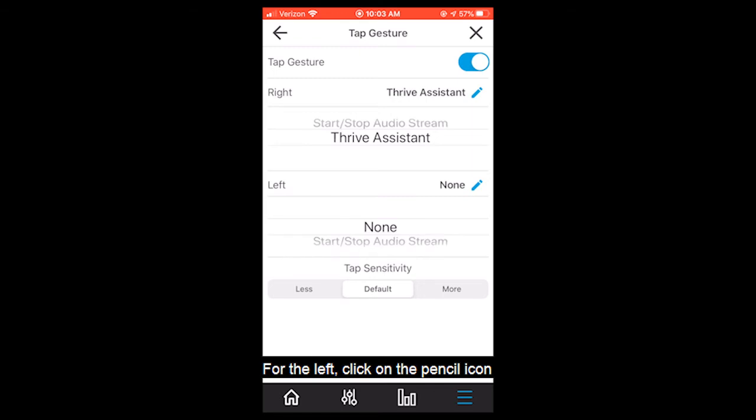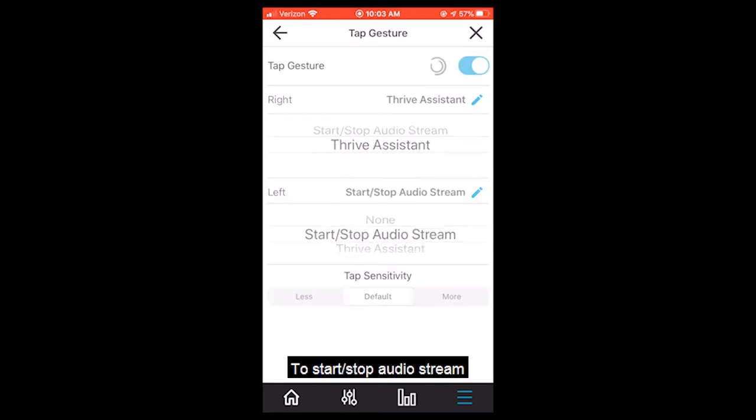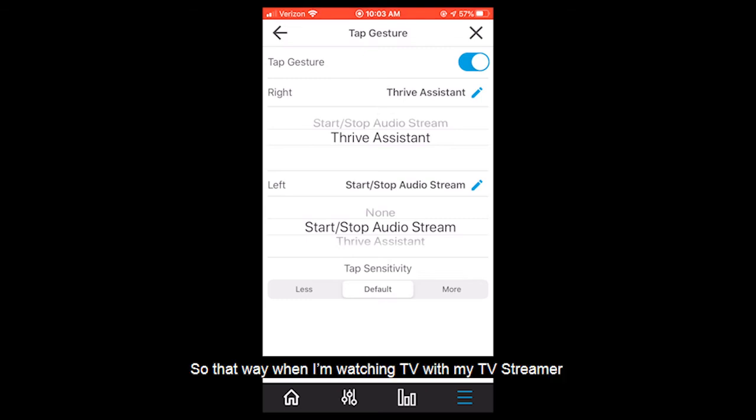For the left, click on the pencil icon and we can set the double tap gesture to start and stop audio stream. So that way while I'm watching TV with my TV streamer I can just reach up to the left hearing aid, do a quick double tap, and start or stop the audio streaming as necessary.